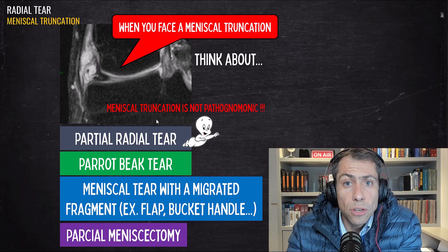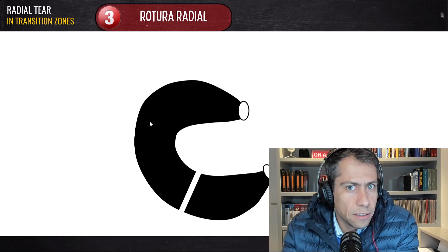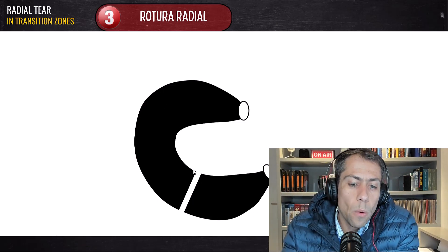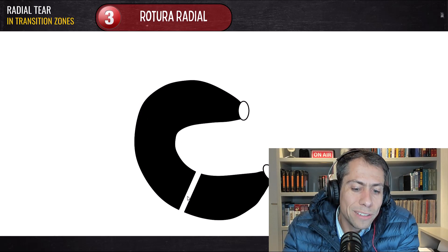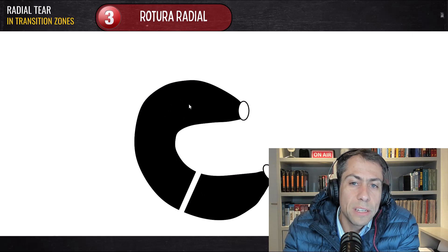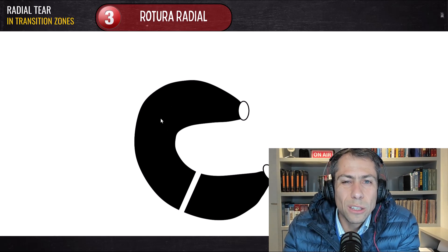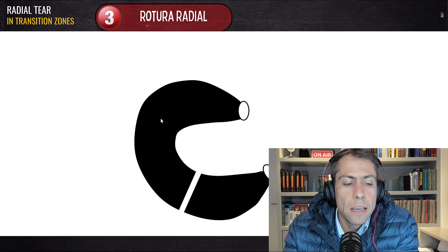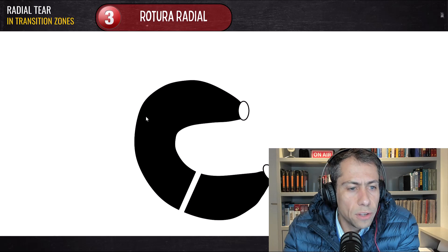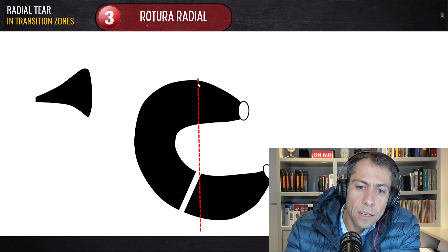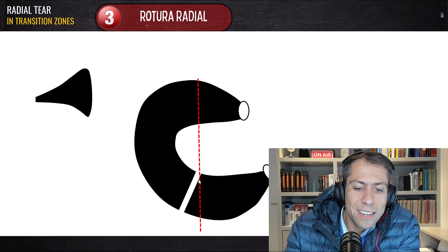Now I want to talk about the radial tears that occur in the areas where the meniscus is curved — because in these transition areas the radial tear looks like a radial oblique or parrot beak tear. I'm going to show you some cases of that.